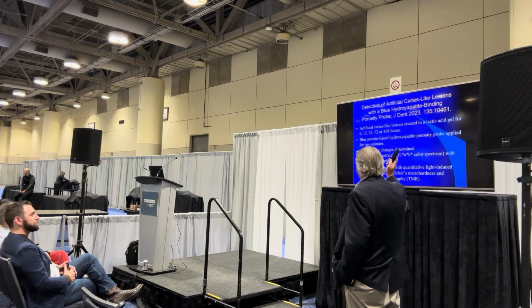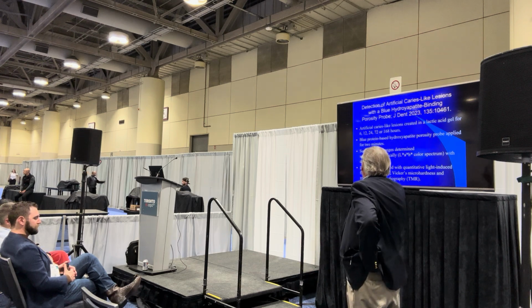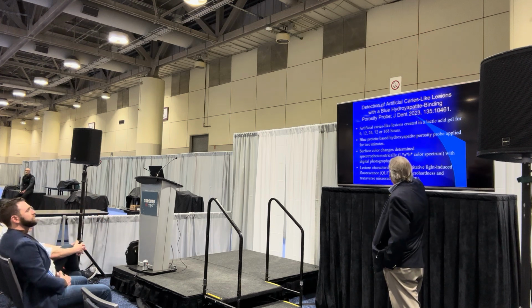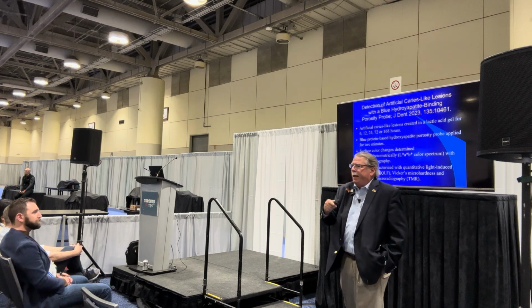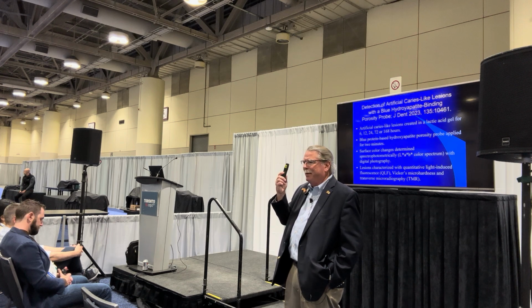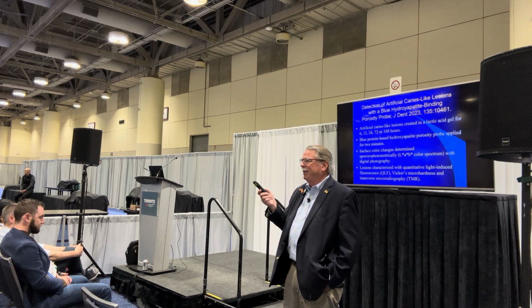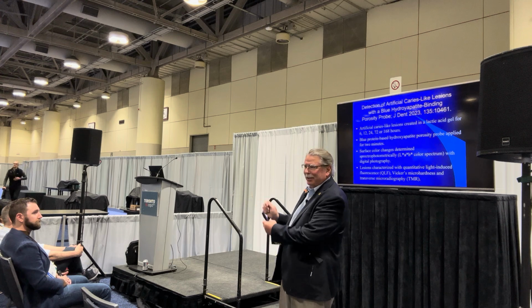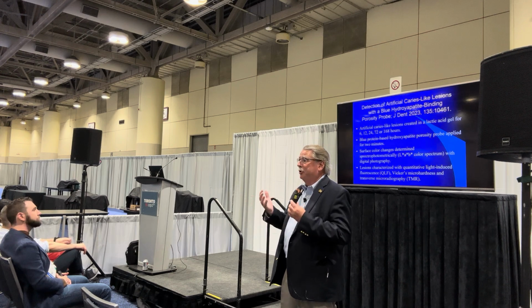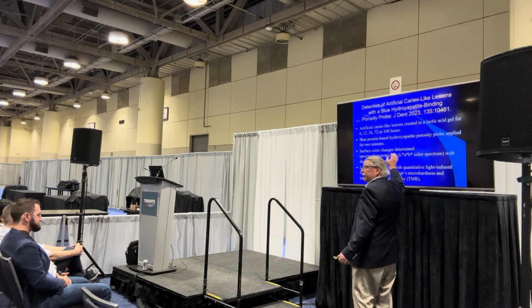They put on the BlueCheck for 2 minutes, rinse with water, and then they evaluated the color changes spectrophotometrically, and this is a standard. If you're not particular with the color spectrum, it's just the natural color spectrum, but if you're kind of jogging your mind for where do I see this all the time, it's on all the bleaching studies you read. When they're trying to tell you how much whiteness, originally they used the Vita shade, took a picture next to the Vita shade, but everybody eventually moved to the LAB because there's no bias in it, because you're still kind of interpreting stuff when you use an artificial system. So this is just a standard verified technique for color change.